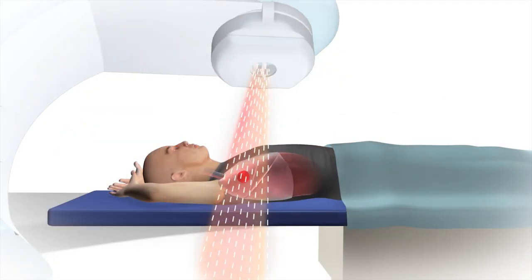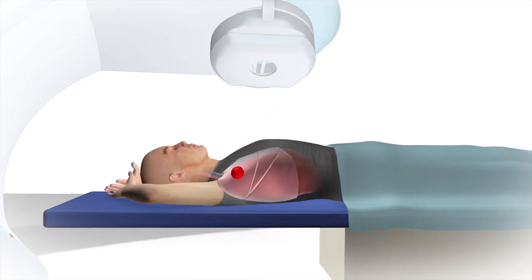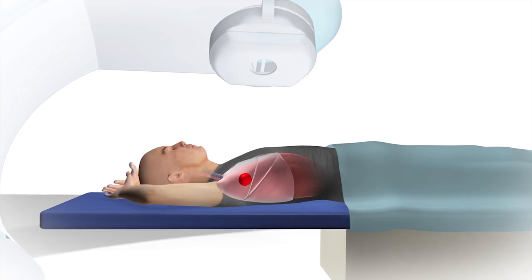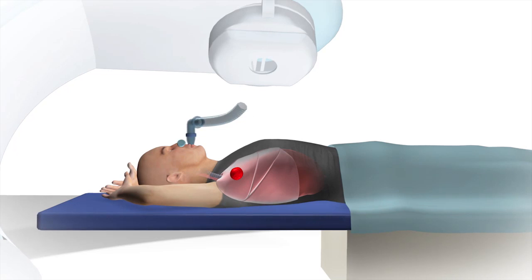As part of your treatment for lung cancer or tumors in the abdominal region, you will be receiving radiation therapy to these regions. One potential concern is the impact of tumor motion while you are breathing. One way to minimize the tumor motion is to use the active breathing coordinator, or ABC.